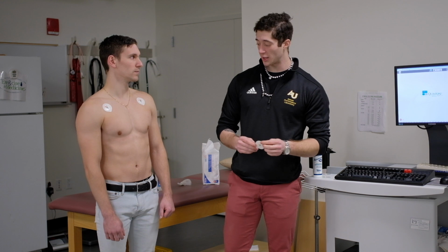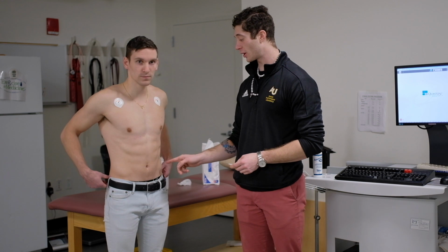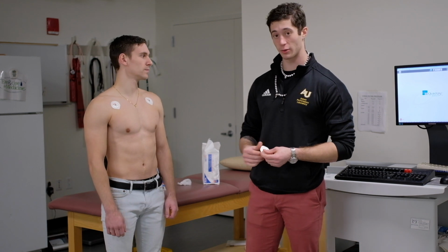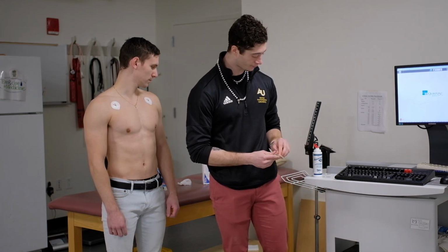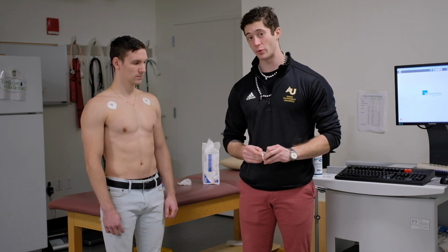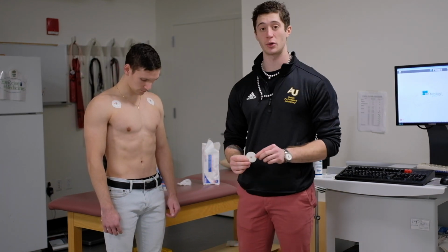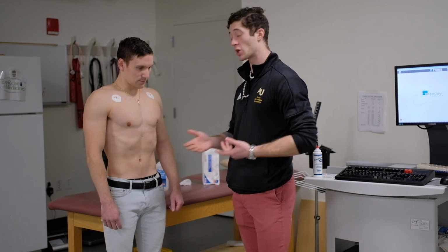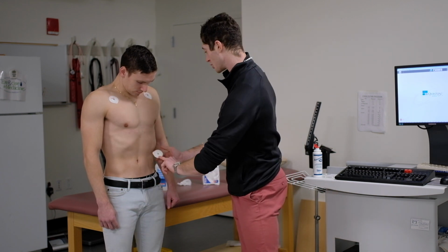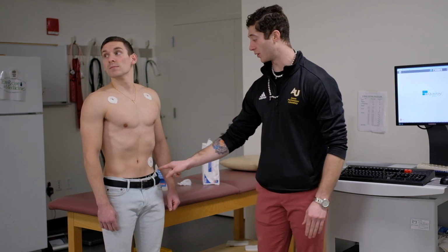The next placements that we have to do are in the same line as these electrodes. However, they're going to go down somewhere between the rib cage and the waist. So these are the right leg and the left leg leads. For the sake of not wasting any more ultrasound gel, because we're not going to be running a test on Peter today, I'm just going to go ahead and place the electrodes where they would be going and guide you through. So we're going to ask the subject to suck their stomach in so we can get an accurate idea of where the rib cage ends and where the hip starts, and that's right here. And remember, we are going in line with the left leg and the left arm.